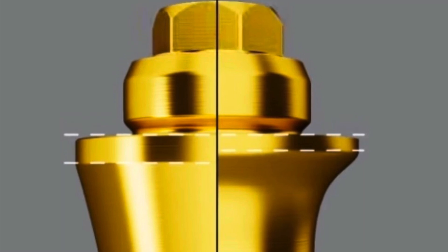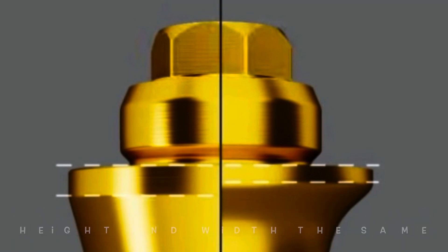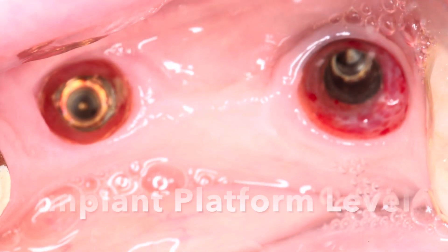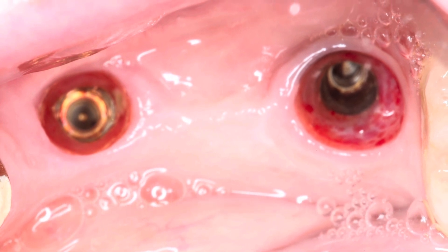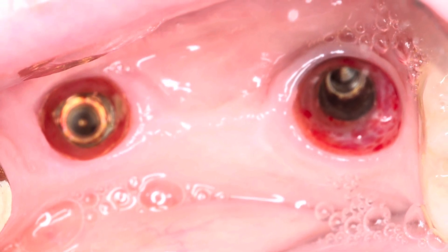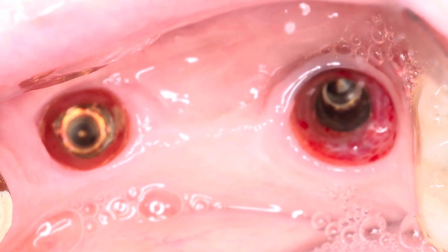The platform itself is the same width and height, so you can take out the old and put in the new very easily. In this case we did some bone grafting and also put a healing abutment on because we wanted to demonstrate how the multi-unit abutment actually works. So we're going to put the multi-unit abutment on now.